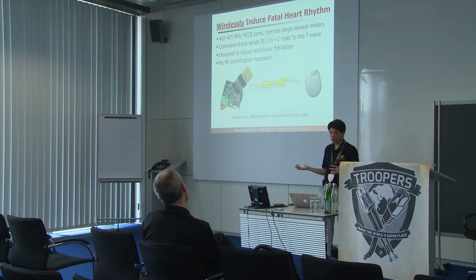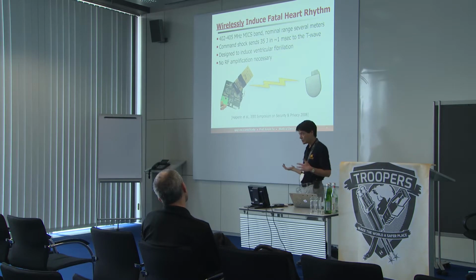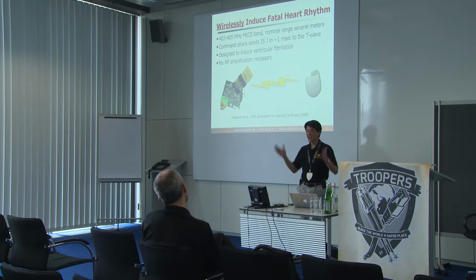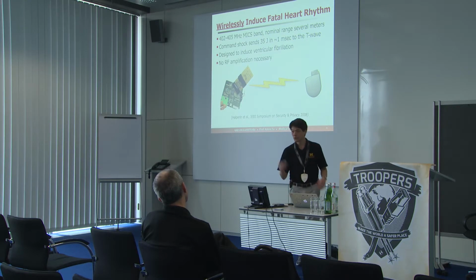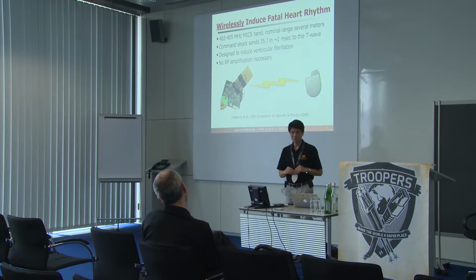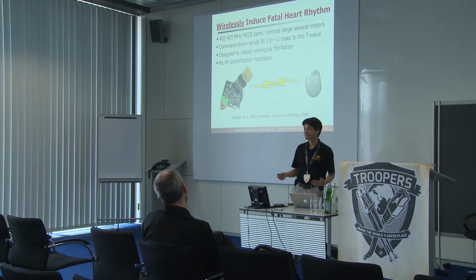So if you recall, I said that when the implantation happens, it needs the physician's test to make sure that the implant is properly implanted. How do you think the team tests if a defibrillator is properly implanted in a patient? How would you test? You send a shock? You send a shock. Okay, I send a shock to your heart, which is in normal sinus rhythm. You're still fine. You have to induce death? You have to induce a deadly heart rhythm.